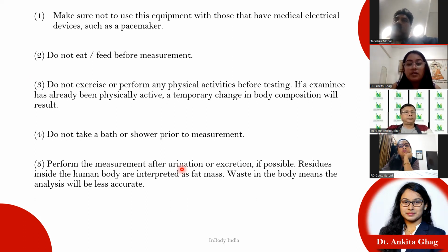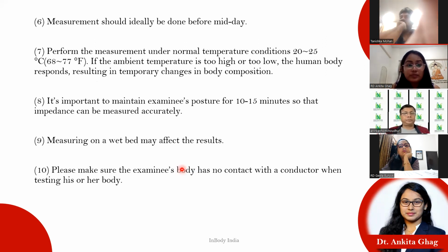Most of the time the test is done post physiotherapy exercises. It's very essential we avoid that, because during workouts or physiotherapeutic actions, there is a slight amount of muscle pumping. That can lead to excessive muscle readings. As it works on the water level, since there is a change in fluids, the muscle will be overestimated. It should be performed after excretion of urine, but at times it is not possible in an ICU setup, so we can skip this pointer.